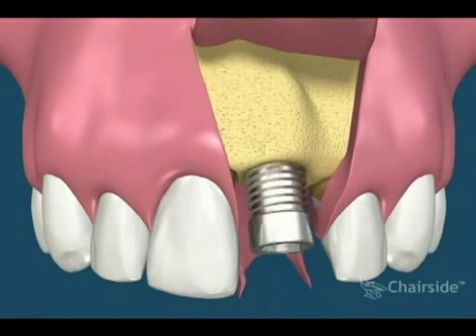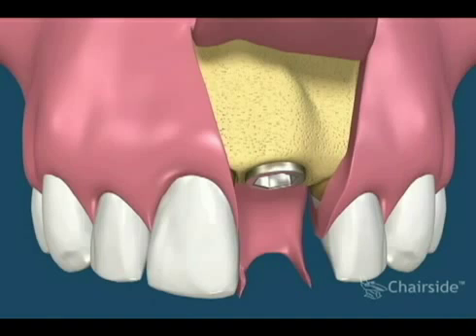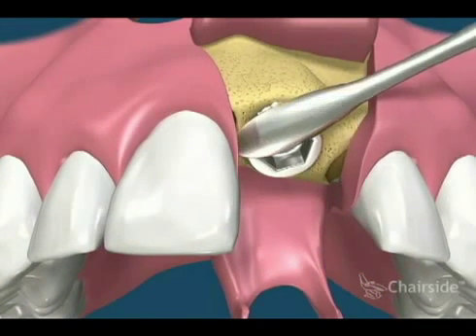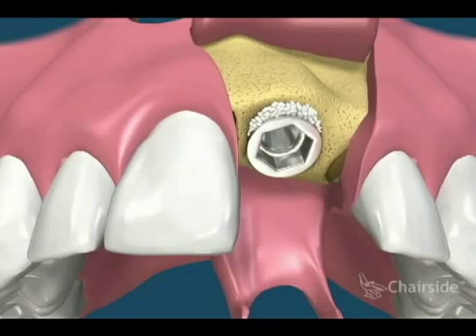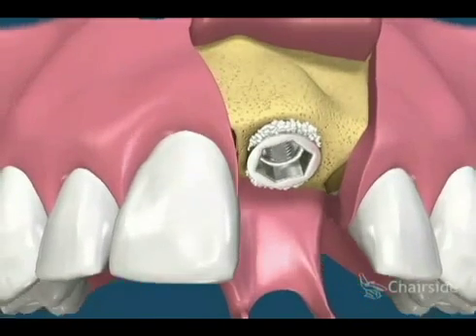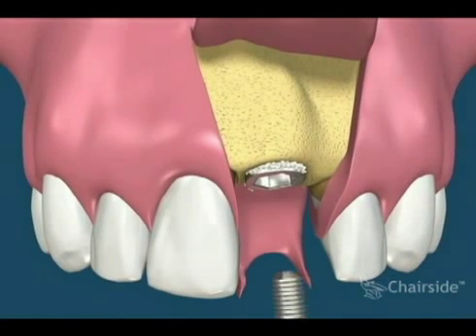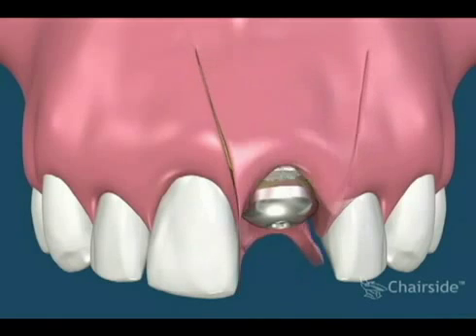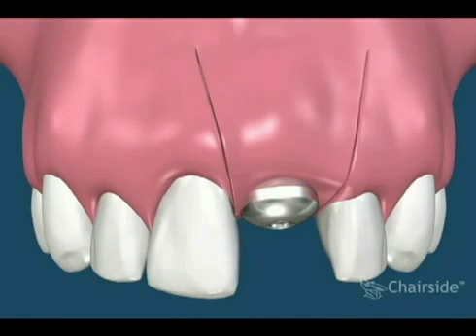The implant fixture is then placed into this prepared site. Note that there is a small void between the tooth socket and the implant fixture. Bone or bone substitute from various sources can be placed in the void. The implant is covered with a healing cap. The gums are repositioned and sutured into place.